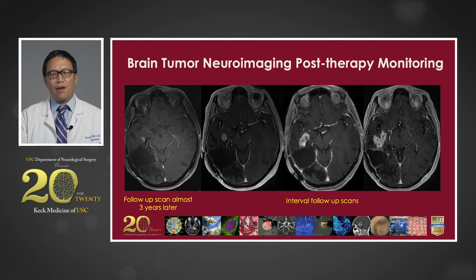If it's tumor, it's generally going to keep getting bigger and bigger and bigger. And as we can see on the very right, the contrast-enhancing lesion was starting to get very big, and the concern for tumor was very high. But at the same time, some of this could also be post-radiation effect, and we wanted to really be sure.